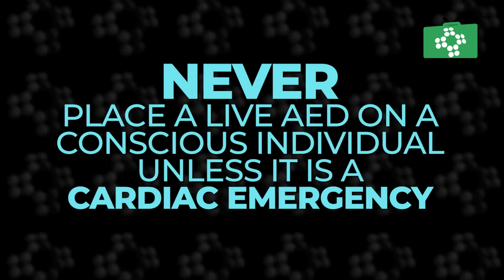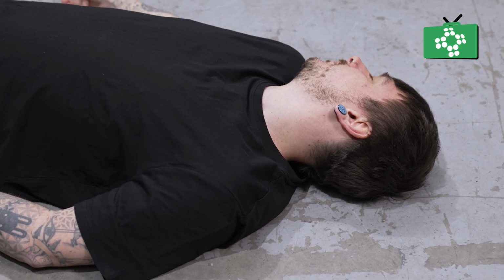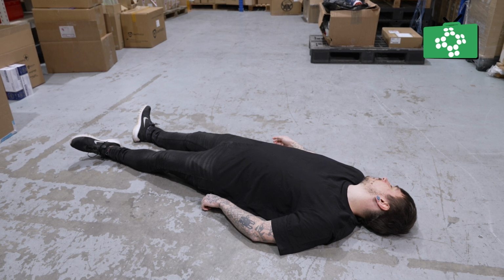In this film, we're simulating CPR and AED use, as you never deliver CPR or put a live AED on a person unless it's a cardiac emergency. When you arrive at the scene and find a person unresponsive on the floor, we first need to establish what the problem is and follow these initial steps before using an AED.